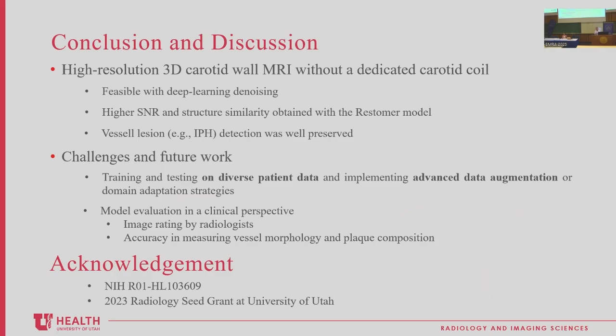But even just by looking at simple samples like this, we feel there are subtle image differences between the original high signal-to-noise images and this so-called denoised, prettier-looking image with a bit of signal gain. With more patient data for training and better performing algorithms, we may actually be able to get there.